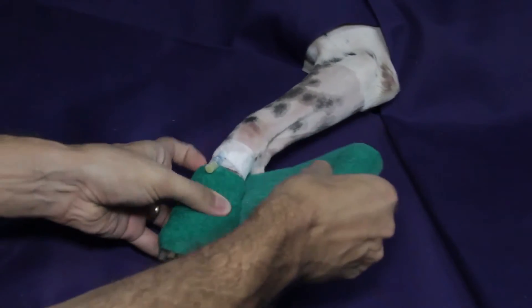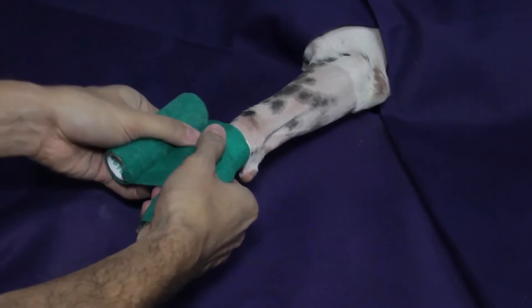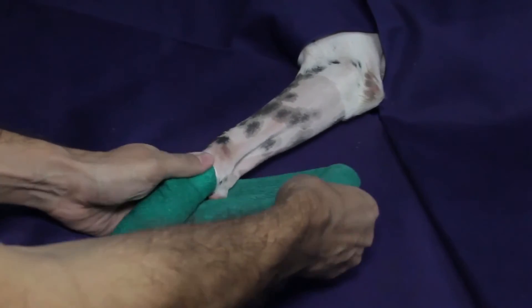Using an elastic bandage, the limb can be exsanguinated to improve the intensity of the blockade. The bandage is applied firmly in a distal to proximal direction.